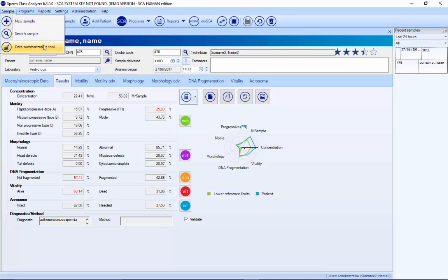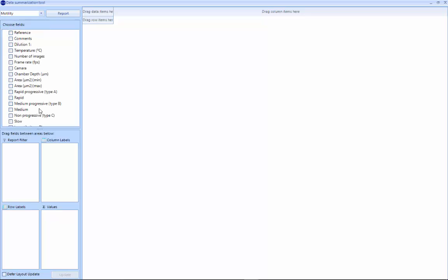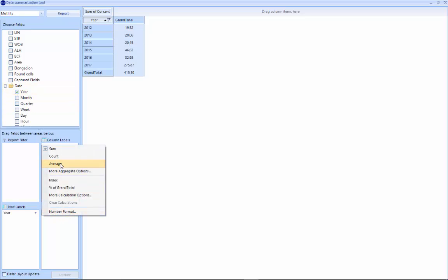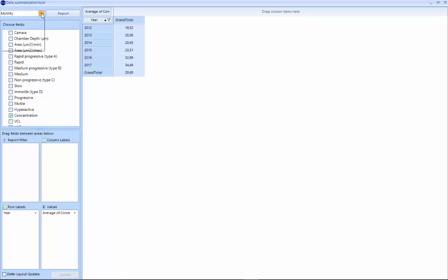And finally, here we have a data summarization tool. The system automatically calculates — for example, if we select average — the average for each year of all the samples in the database. We can select all the parameters, such as concentration, and all these can be exported to a report.